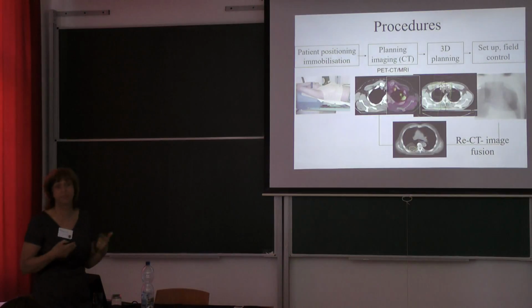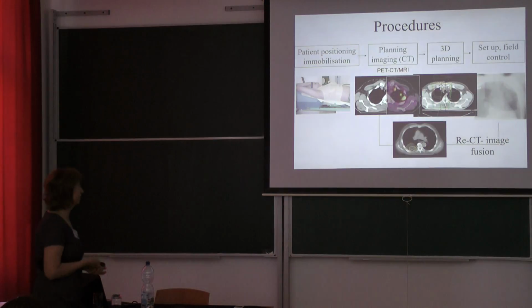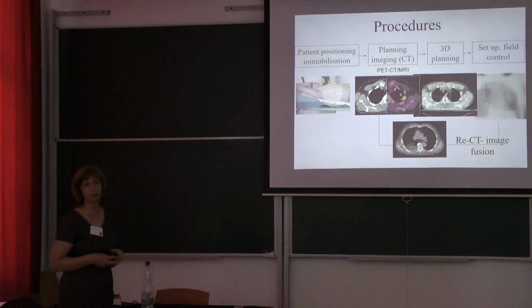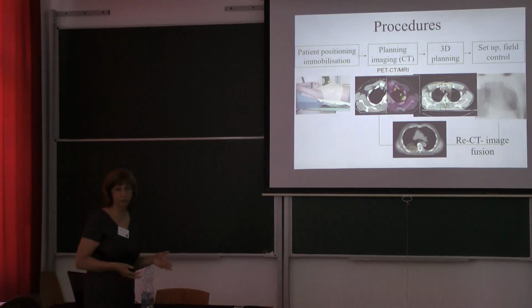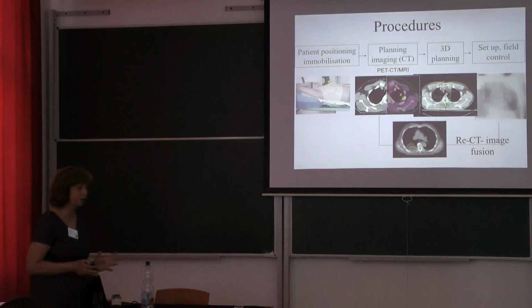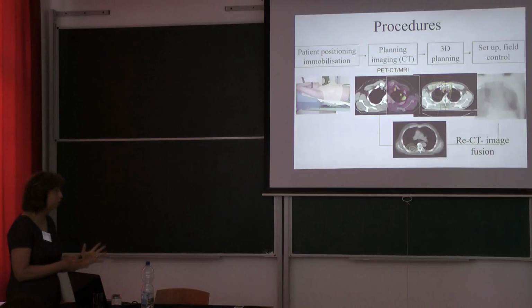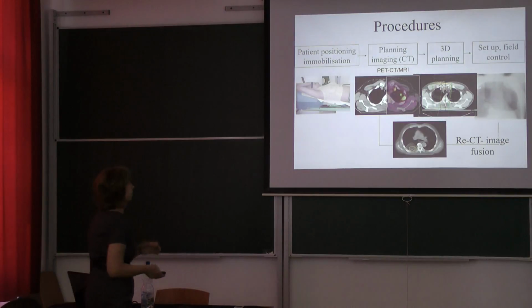The patient is breathing, the lung is moving, the liver is moving, and so on. The bladder can be filled, flatulation may occur. So there are a lot of things which are changing, and we have somehow to assure that the therapy is given in the right place, because we were able to plan this therapy in millimeter accuracy.